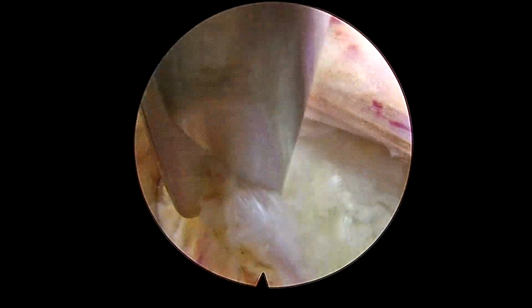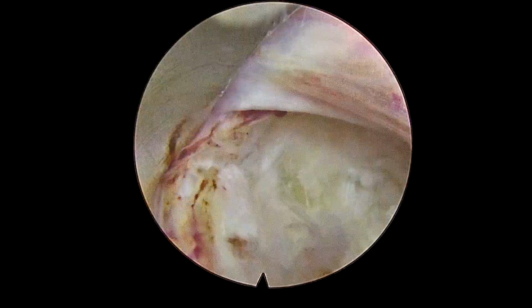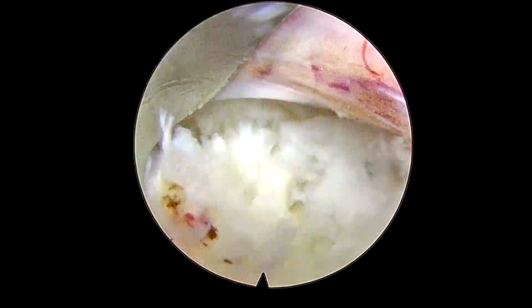This is the part of hardened annulus superiorly near the superior end plate. So we have removed the annulus from the inferior end plate. We have removed the annulus from the superior end plate. We have removed from the midline as well.